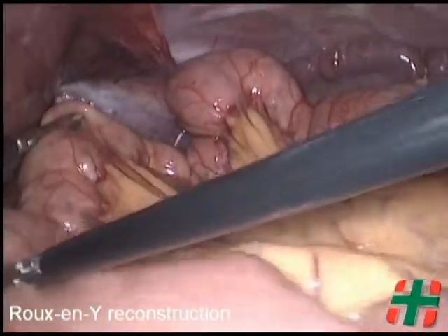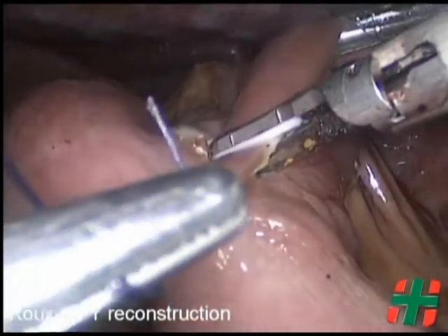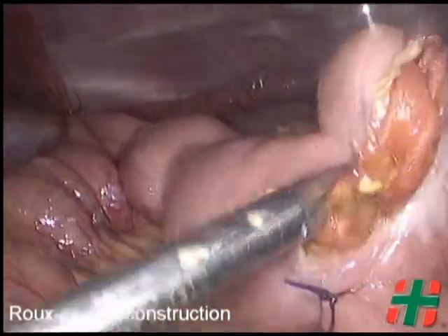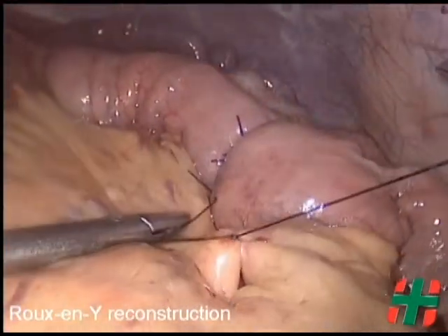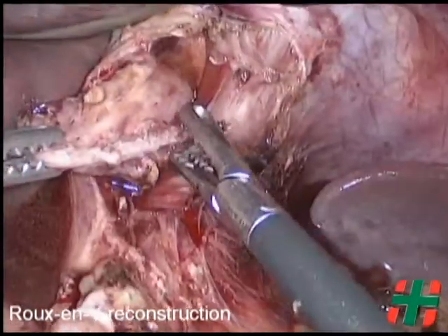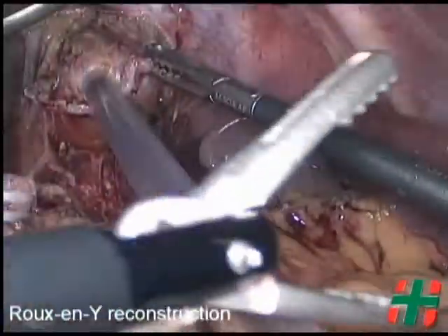The jejunojejunostomy is performed using a vascular cartridge, and the enterotomy is then closed with a running 3-0 absorbable suture. We close the mesenteric defect to prevent internal hernias. The alimentary and biliopancreatic limbs are divided to create a Roux-en-Y reconstruction. With an orally introduced anvil and a number 25 circular stapler, the esophagojejunostomy is performed. The blind end of the Roux limb is transected using a wide cartridge of a linear stapler.